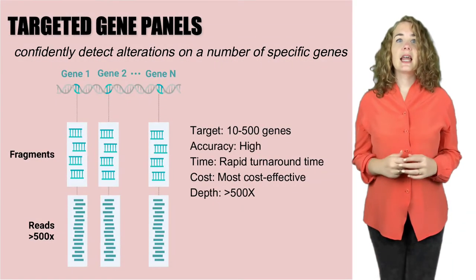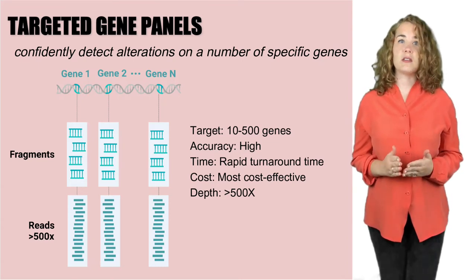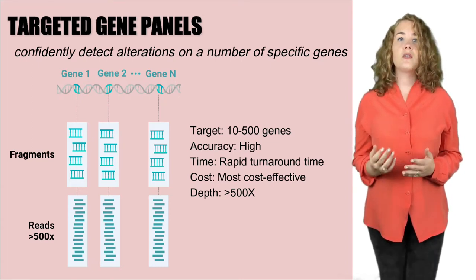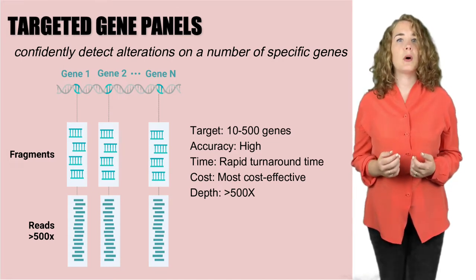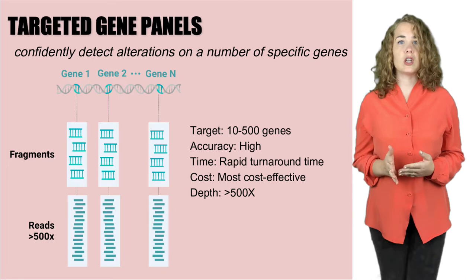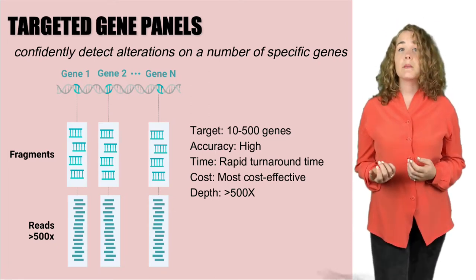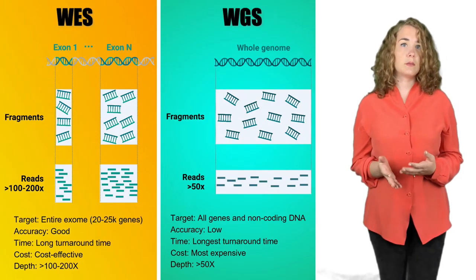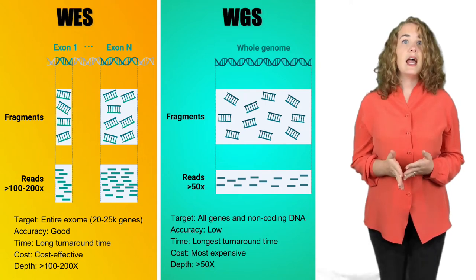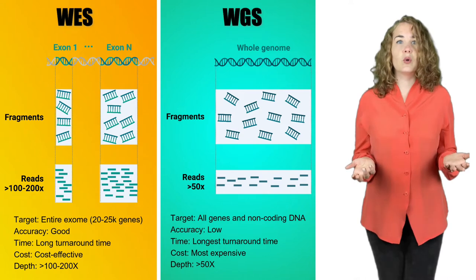Gene panels can get very high coverage on selected disease-specific genes and are therefore widely used in the diagnostic setting for the ability to spot well non-hotspot mutations on specific genes at high depth with reduced time, cost and data burden.